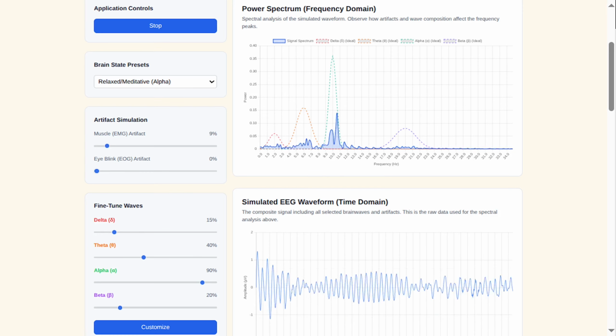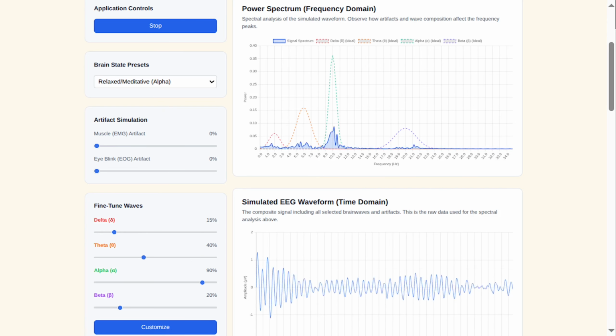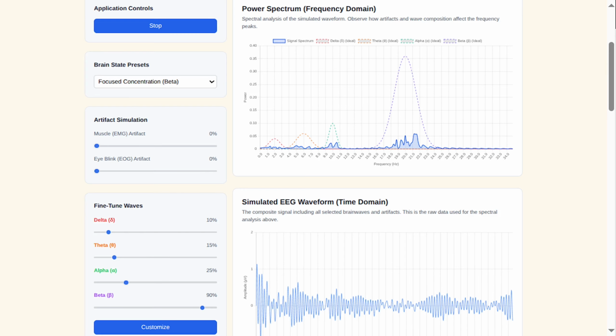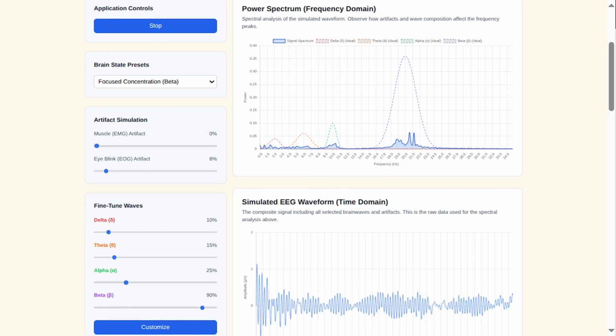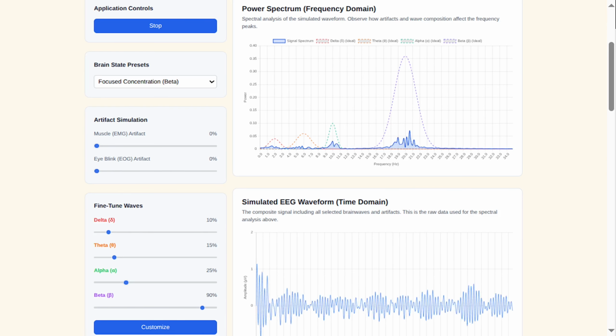What else is there? Yes, there are also minimally invasive options like subdermal electrodes, placed just under the skin, offering a middle ground. There are also newer techniques like near-infrared spectroscopy, fNIRS, which measures blood flow and oxygenation changes from the surface. Okay, we're not talking about fNIRS for now. Tell me more about the subdermal electrodes, and do they have any other name?